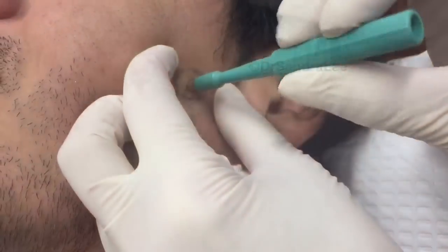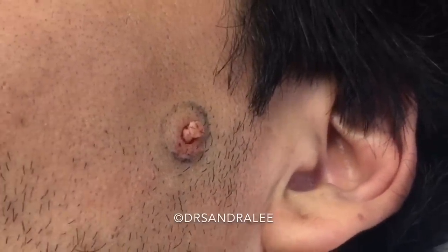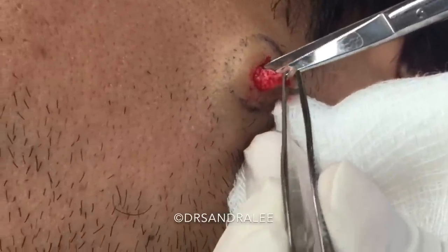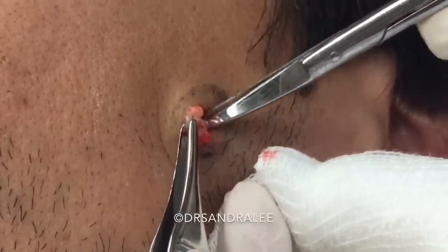So what is that like? It is really fun. You and I have a different way of expressing ourselves, I guess. I'm using what's called a little punch — that's what we use to kind of make a little... and you are correct, this is definitely a cyst. I see the cyst contents right there. It's a good one coming out, actually. It's a very nice one.